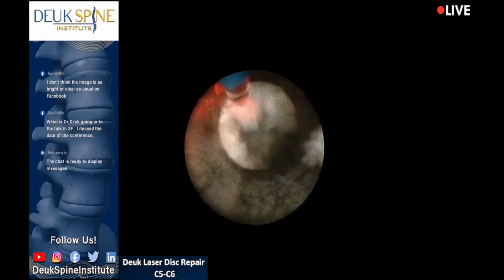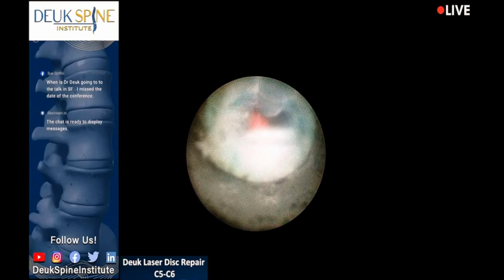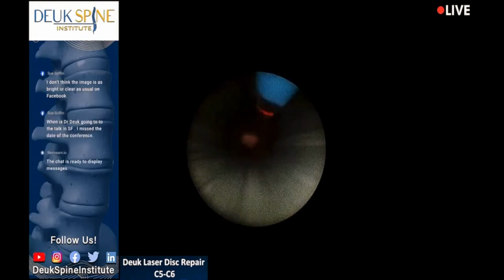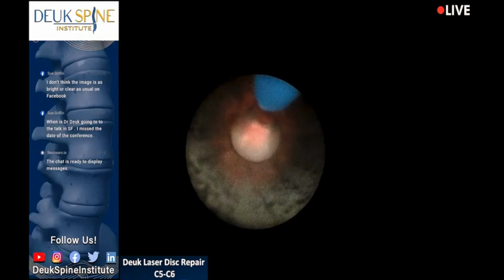And then you can see the nerve root right there in the foramen, and there's no herniated discs anymore on the nerve root. We got them all out of there. I had to open up the posterior longitudinal ligament and get all those fragments of disc herniation out of the epidural space that were pushing on your nerve. And I got a good look at everything and it looked fantastic. So I think you're gonna do great.